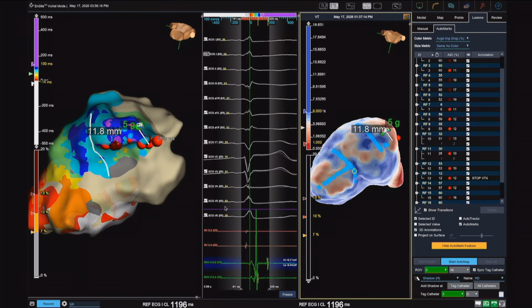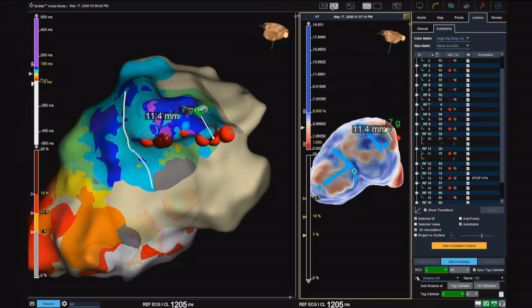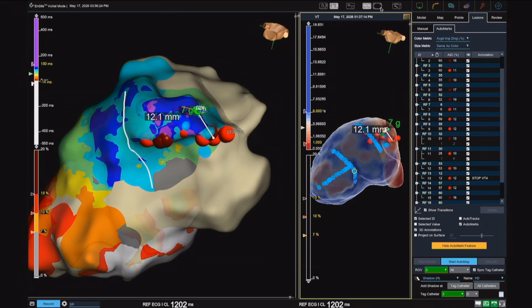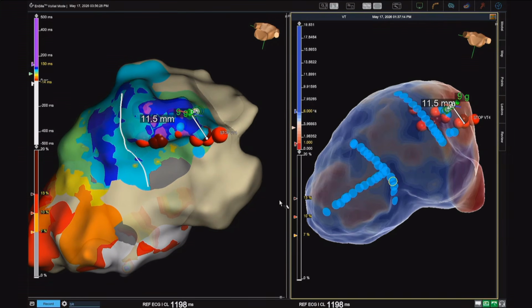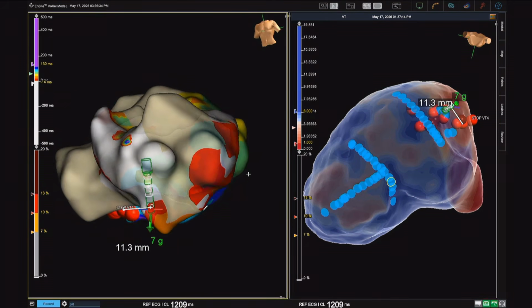So it's this one. And what we have done so far is, here we had also nice diastolic potentials. If I may stop for the audience, can we go to something like AP or some view, just to know what's what? Because maybe the audience is not familiar. So can we go for AP and rotate to the area of interest? Yeah, so generally this would be the partially mapped.